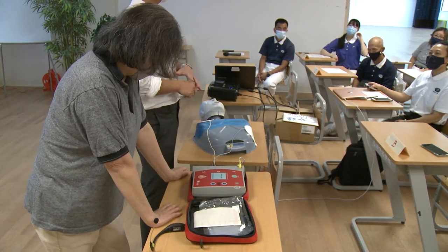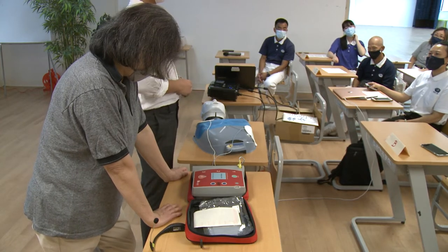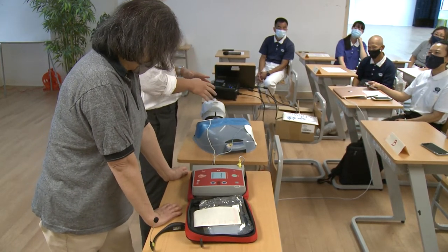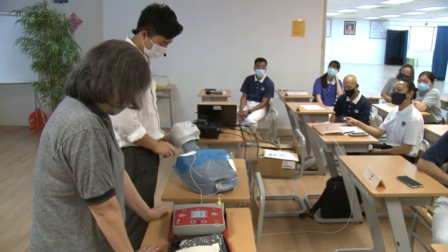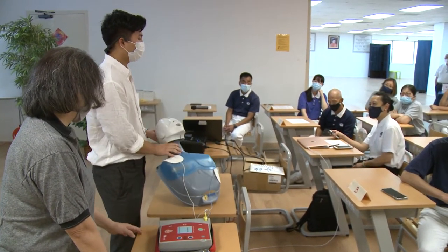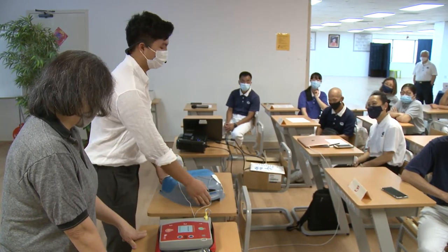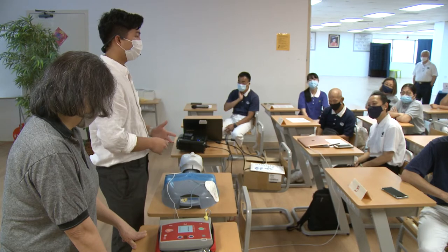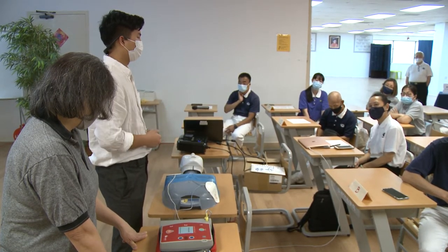Right. And as soon as it says shock delivered, you can start compressions immediately, up until you see the person actually start moving. You can check the pulse if you're comfortable. It's right by the side of the neck. For many people, it's difficult, especially in a stressful situation, so it's no longer recommended. And you can get an idea of when the patient is revived by if they start moving.